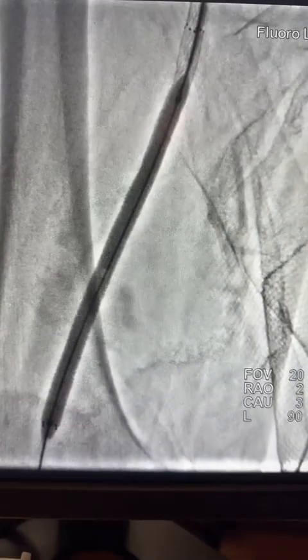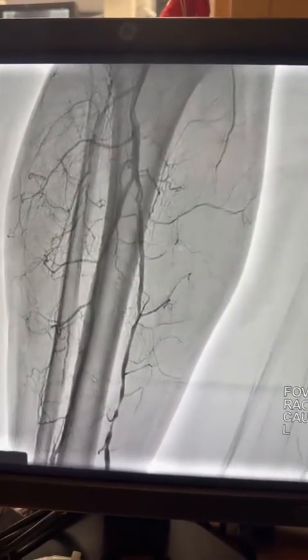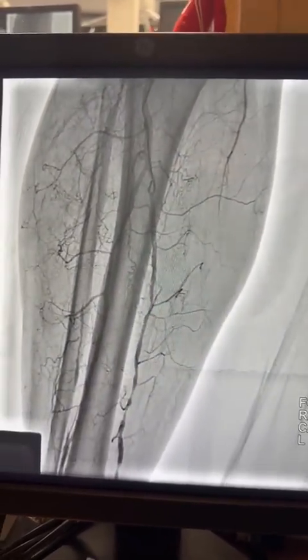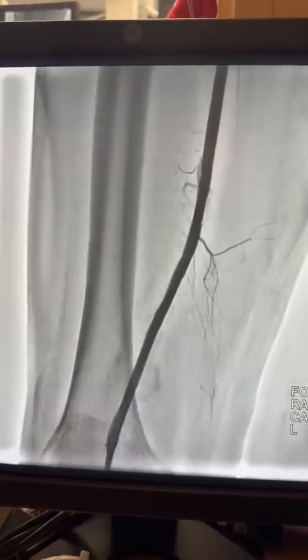I then dilated the stent with a 6mm balloon at high pressure. Here is the final result — there is some residual disease distally, but at least we have retrieved flow below the knee. There is some disease in the posterior tibial artery that we may work on in the future, but for now we have decent results.